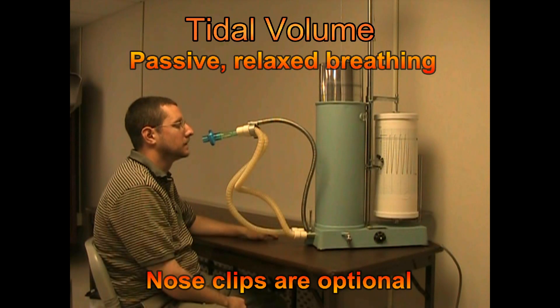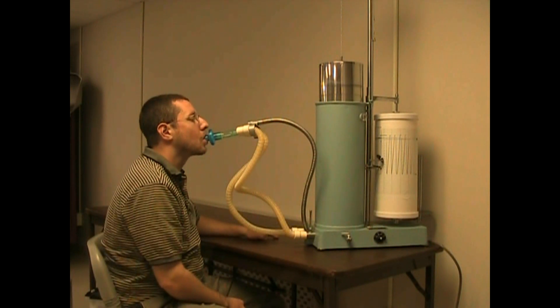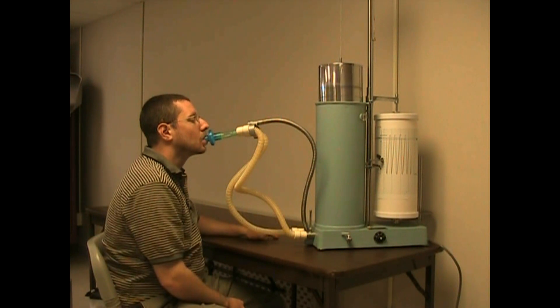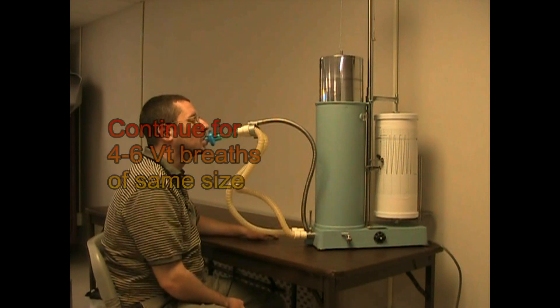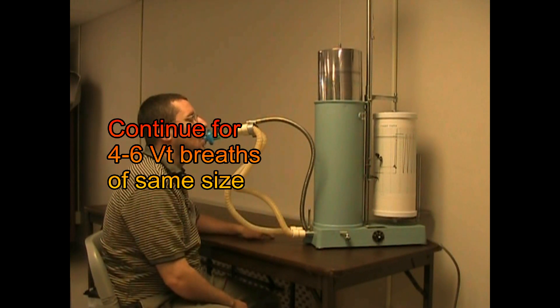Let's now look at how to do basic spirometry. The first demonstration we're going to do will be tidal breathing. The patient can either use nose clips, or if they're competent, you do not need to always have the nose clips on. We'll have the patient simply put the mouthpiece in his mouth and just breathe normal — in and out, gentle breathing.